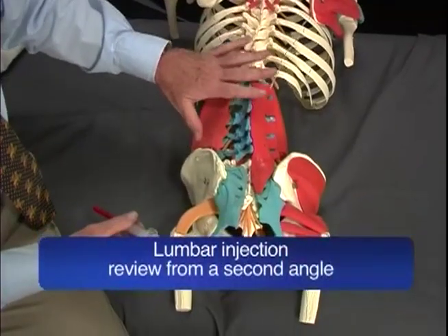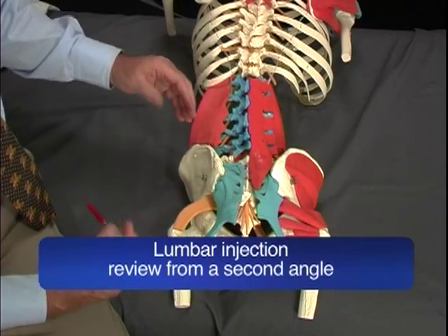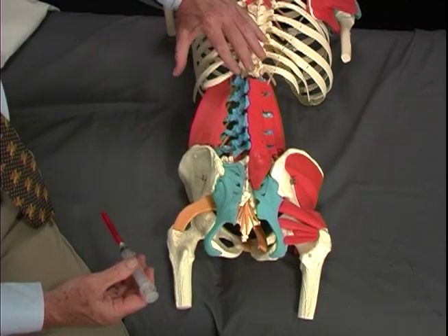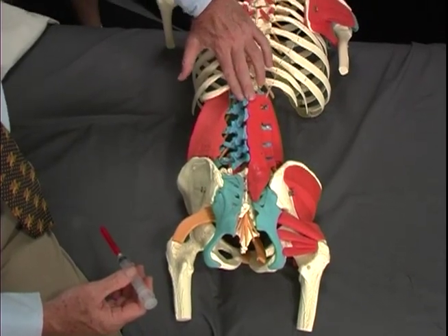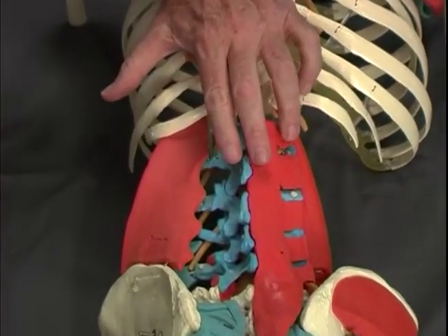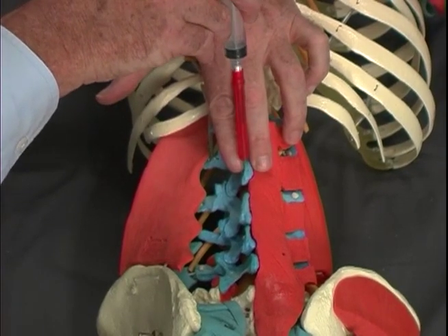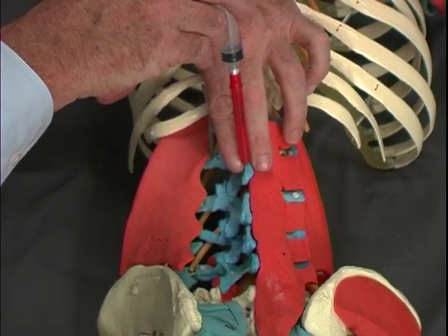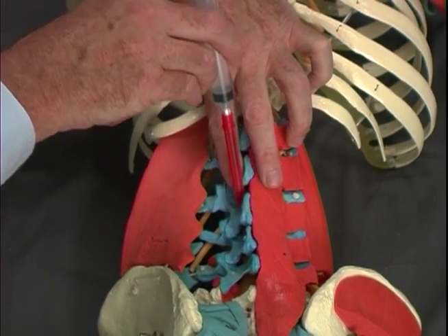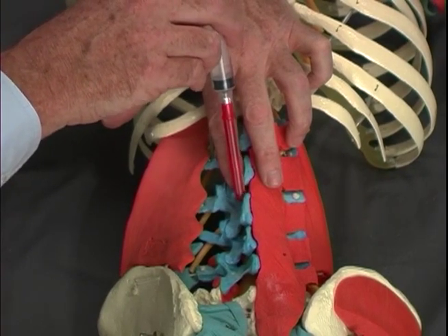In injecting the lumbosacral area, we can stand to the side of the patient and a bit caudally. We can then carefully palpate the spinous processes, the interspinous areas, and then with our fingers locked over the spinous process, coming directly down onto the spinous process, doing skin sliding or re-entering with our needle into the interspace between the spinous processes in a caudal direction with our needle.